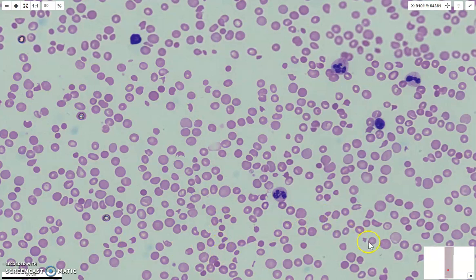All of these little fragmented red cells have occurred because of a mechanical damage in that they've passed through these vessels that have been blocked and that have sheared the normal red cell into these little fragments. So you're looking for those, and of course when you have these fragmented cells that are being destroyed, that basically stimulates more red cell production in your bone marrow, because obviously it's trying to compensate for the destruction of these cells.